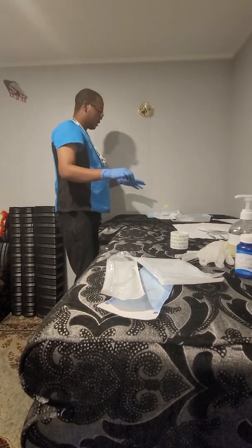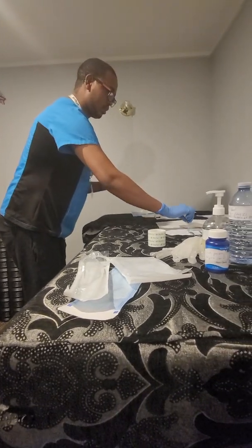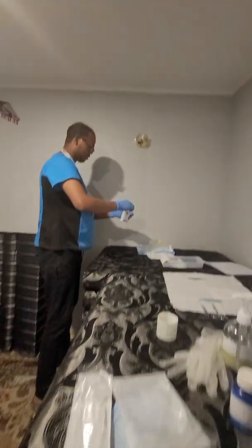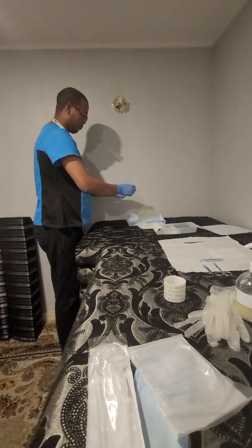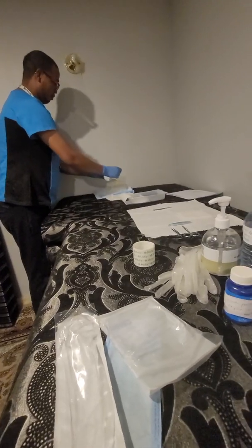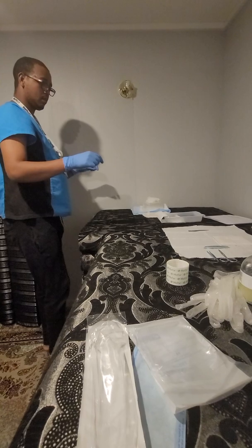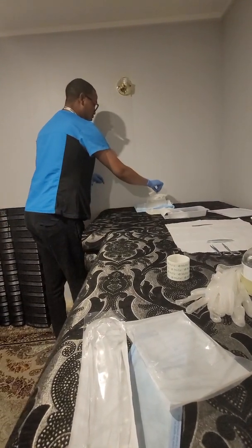Then finally put this one. So after I cleaned it, I just let it air dry. Don't forget that one, it is dried by air. So I'm gonna put these two 4x4 together. Okay, now I'm gonna put this one over the top.